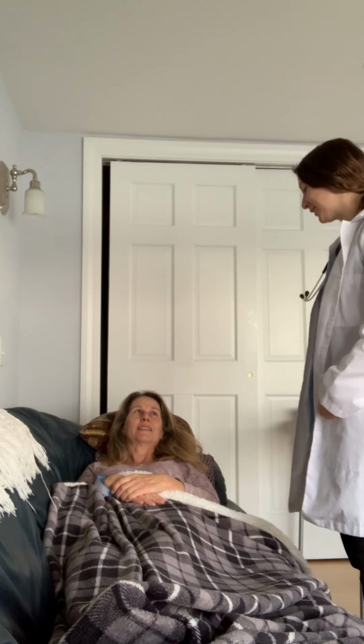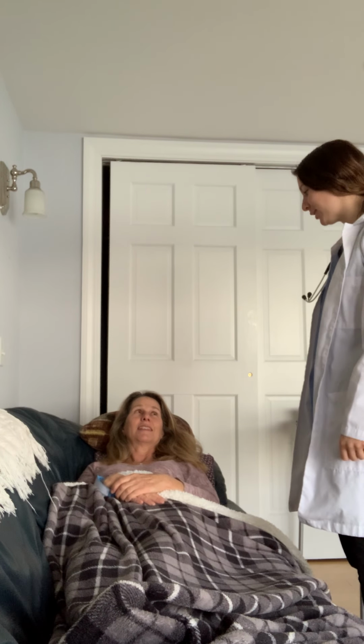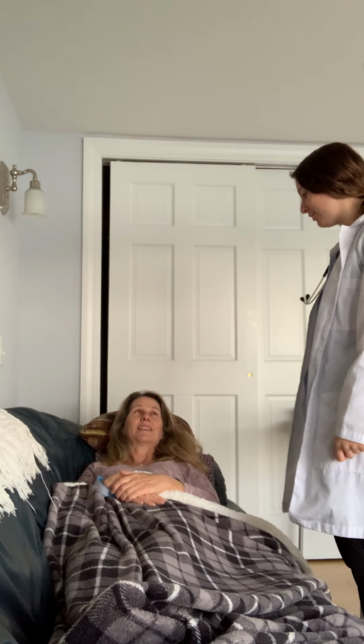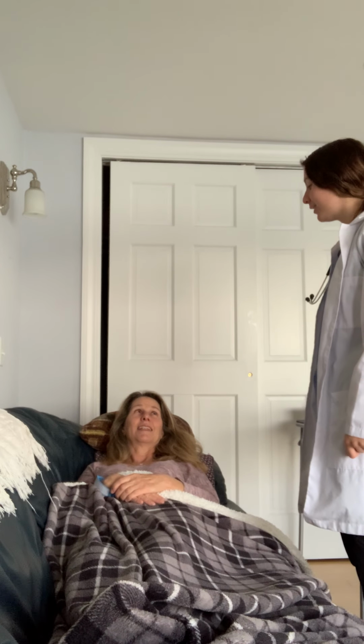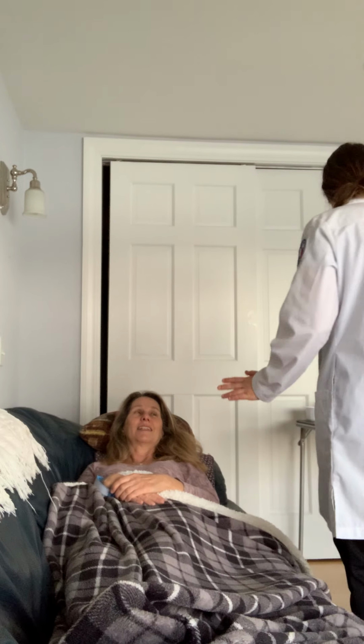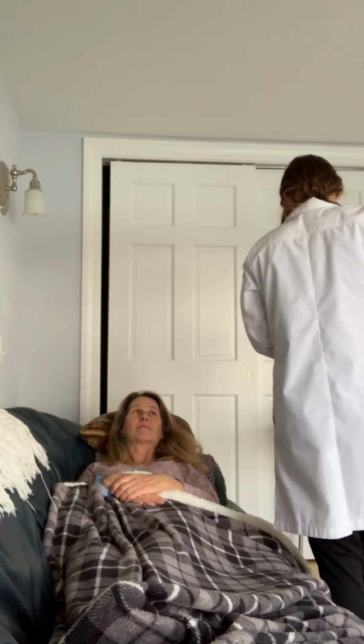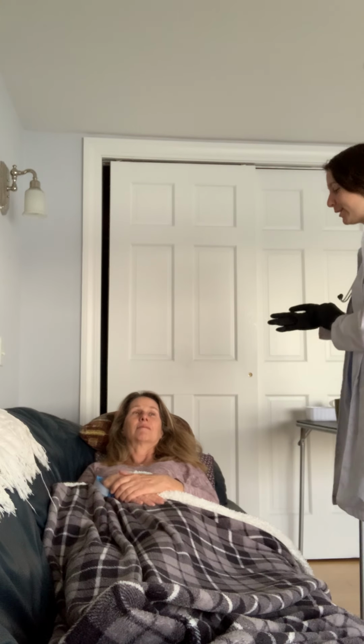My name is Allison. I'm going to be your student nurse for today. I'm going to be administering your feeding through your NG tube. I'm going to go wash my hands and get some gloves. Okay. I'm closing the curtain behind me for privacy.